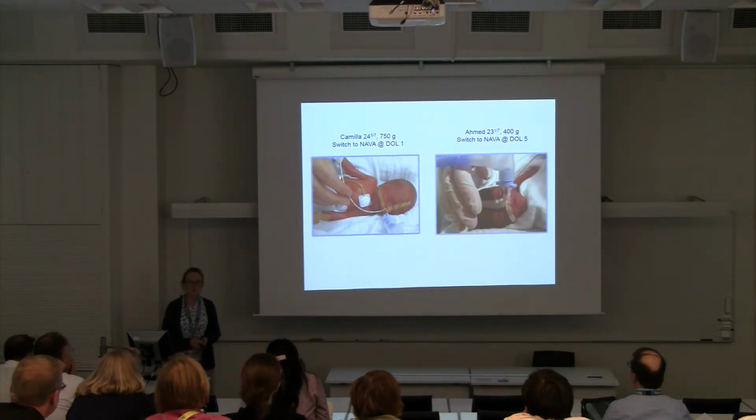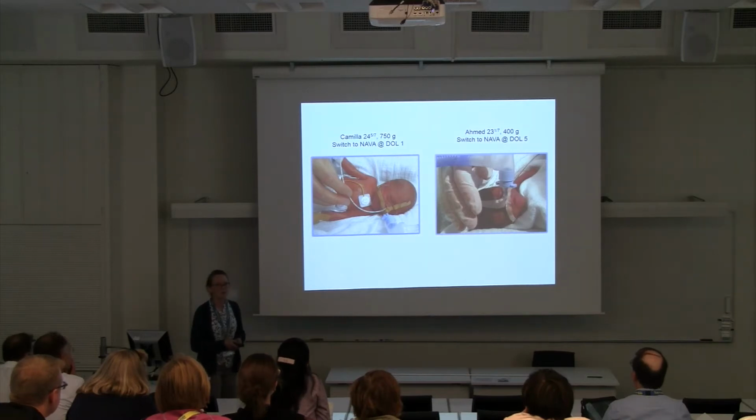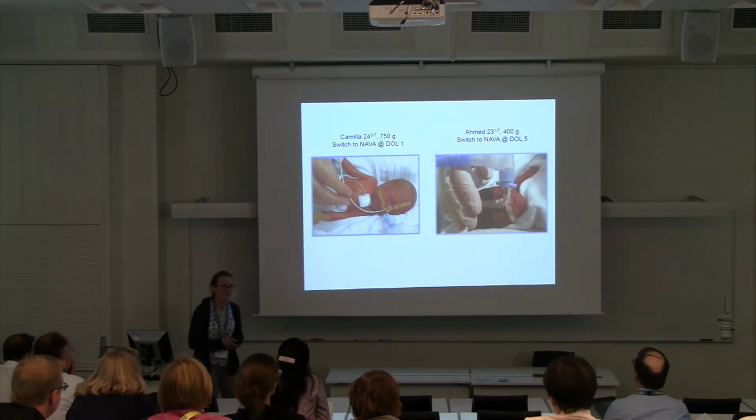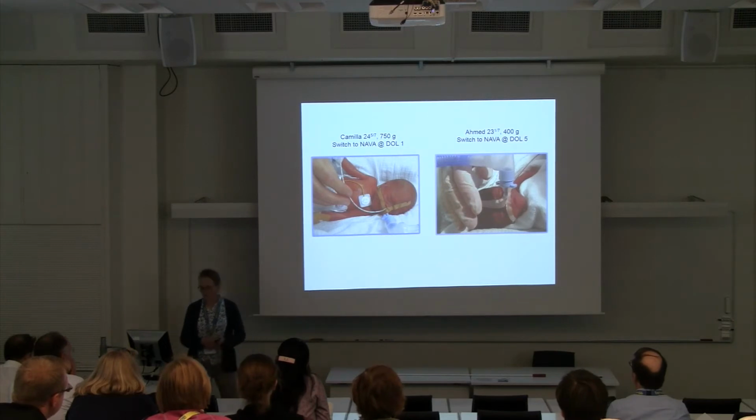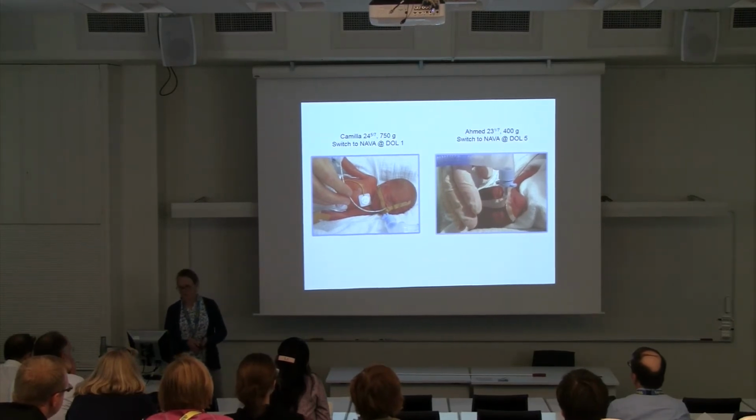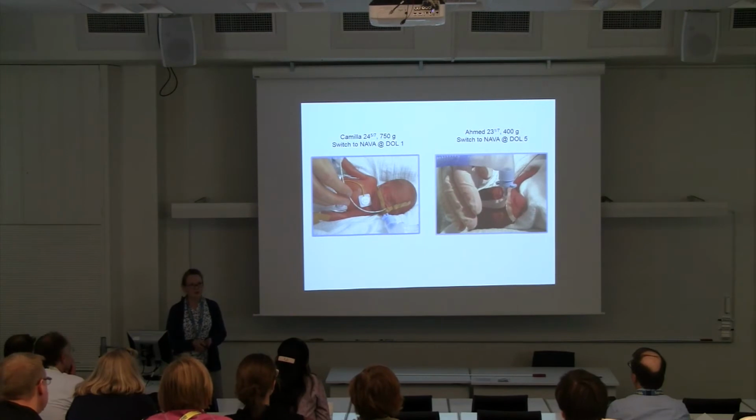I will take you through my presentation with these two infants: Camilla, who has been taken care of in Servo-i, and Ahmed, who was taken care of in Servo-n. If you are familiar with either of these ventilators, you can just follow the right or left side of the presentation. Both infants were quite small, 24 and 23 weeks.